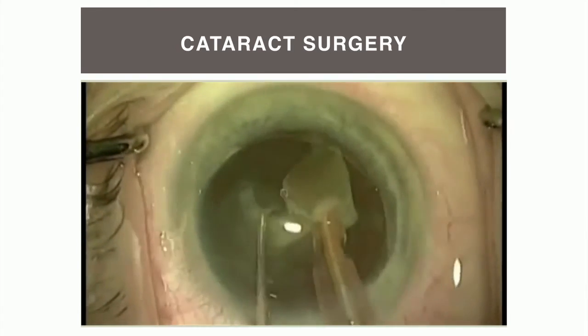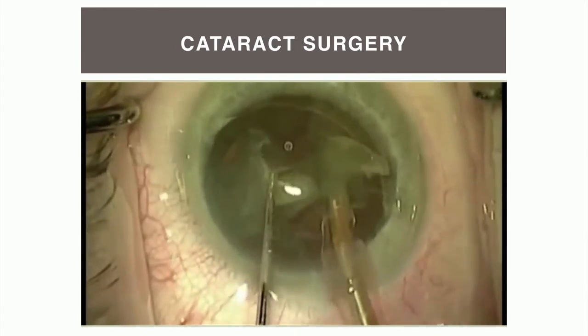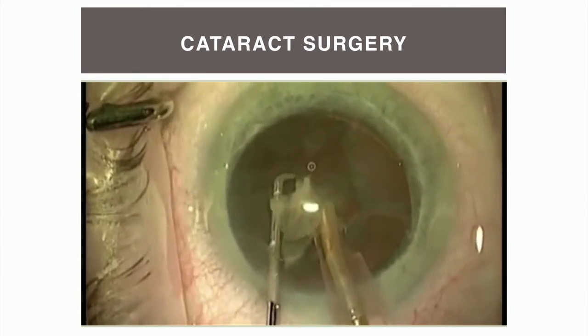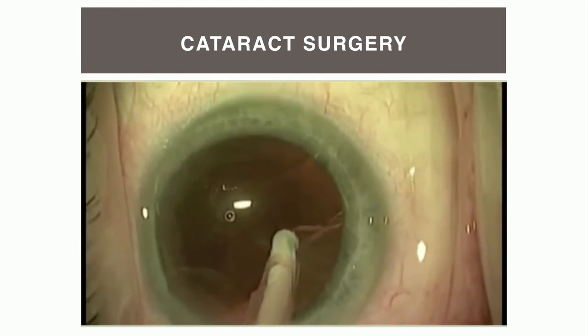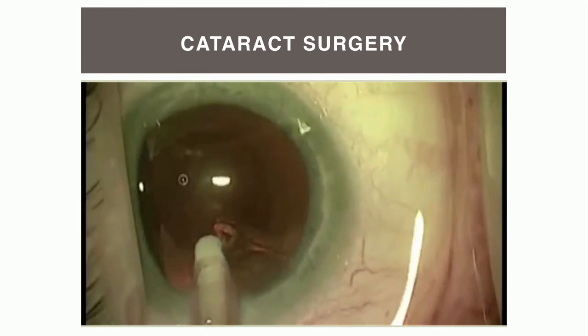So this altogether takes him about 5 minutes or so to do. And I would say that's pretty typical for a surgeon that operates a lot. What you'll see is after the cataract is fully removed, then there's some remnants that are removed here. These are the softer little bits out on the side.